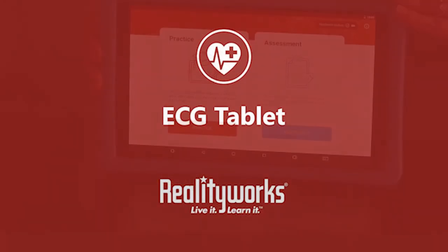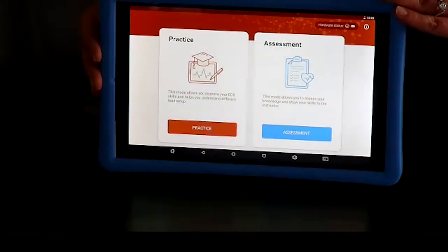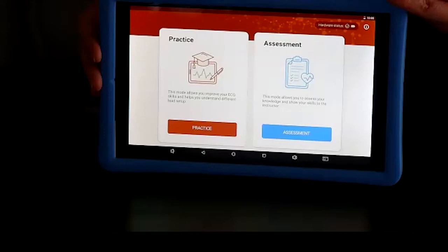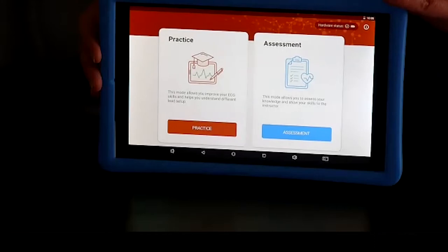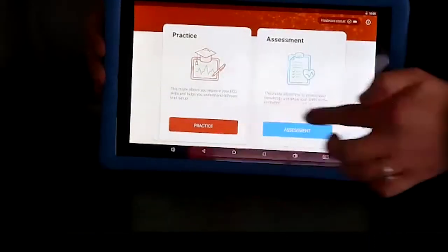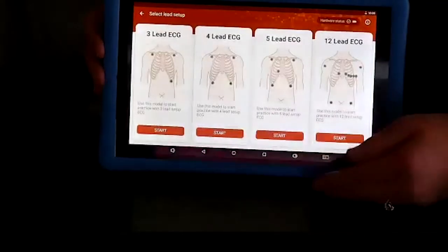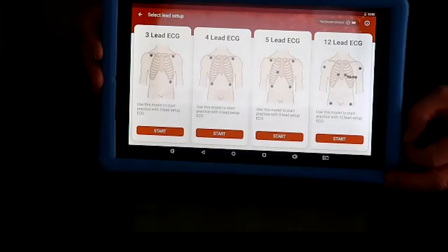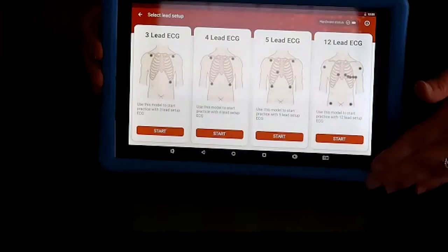So let's take a look. On the tablet, you'll see that there are two main modes: practice and assessment. Practice allows students to improve their ECG skills and help them understand different lead setups. In assessment mode, students can assess their knowledge and show their skills to their instructor. By selecting one mode, you'll see the choices of 3 lead, 4 lead, 5 lead, and 12 lead ECG. Have students select the one that they will be practicing on.